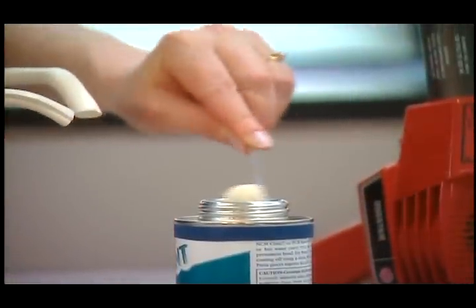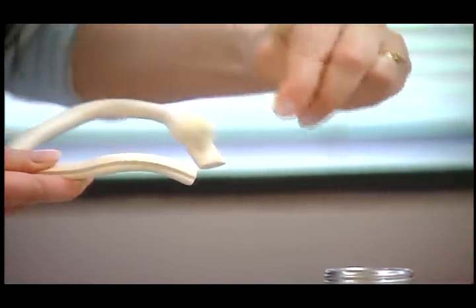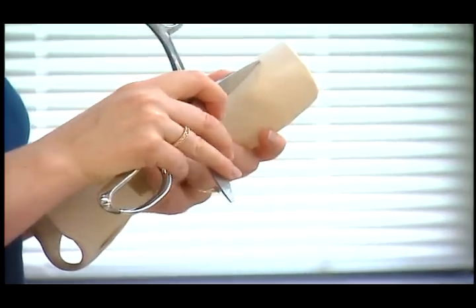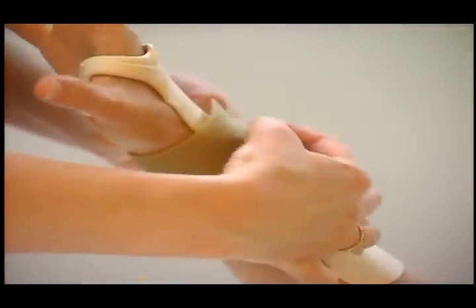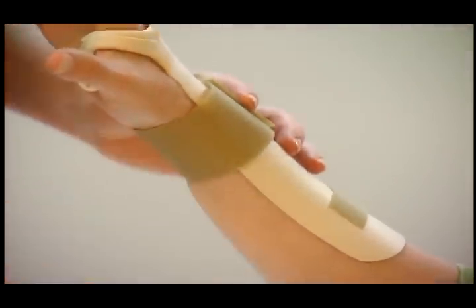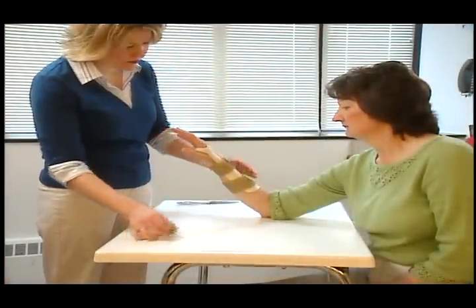Depending on the material being used, the surface of the splint may also need to be prepared by using a solvent to remove a non-stick finish or by scoring the plastic with a sharp scissors. Soft brush Velcro or other foam strapping is then used to hold the splint securely on the patient. You may need to pad the splint to enhance wearing tolerance and patient comfort.